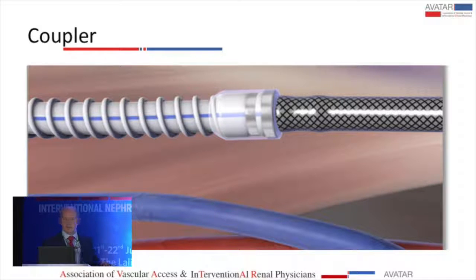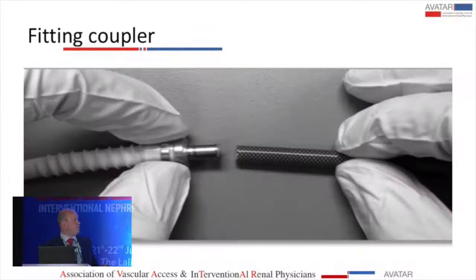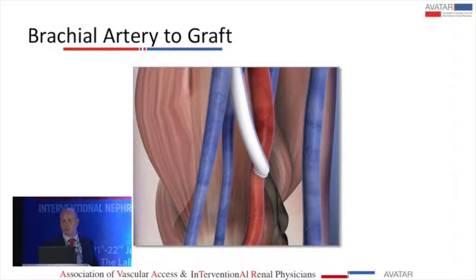But if you can't get across, there have been a few reports now out of Germany, where they're using the Surfacer device, which comes from the same company. I think there was a presentation on it last year, but I'll just run through it quickly. This is a device that comes up from the leg, from the femoral vein. It goes into the stump of an occluded SVC, and then you put a marker on the skin, and then you just turn the screw at the bottom, and a sharp needle comes straight out through the skin. And then you can place a wire through this for through and through access. And you can either place a line, or there have been a couple of reports of placing HeRO grafts through that access, which sounds quite appealing for some people, I have to say.